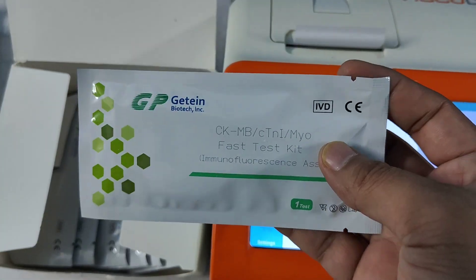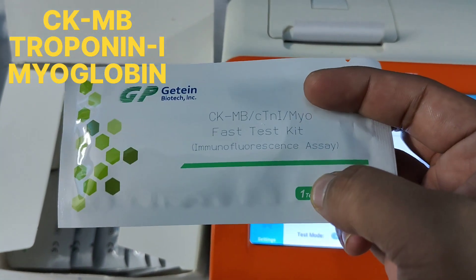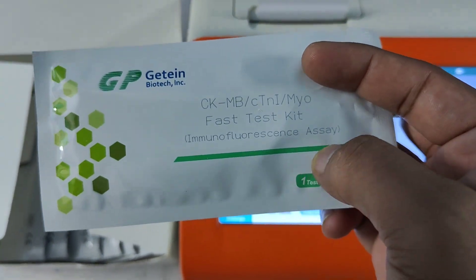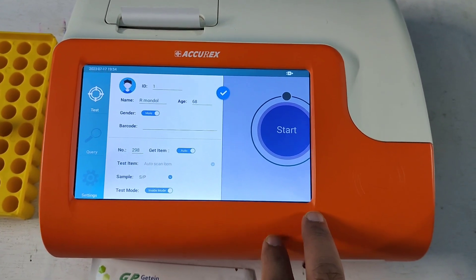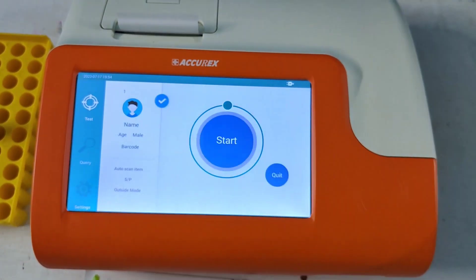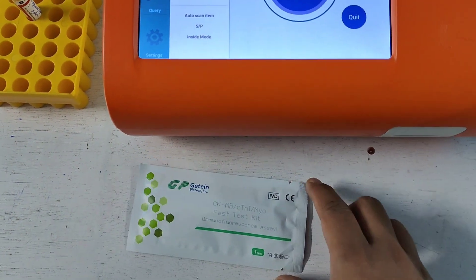Here is the kit by which I am going to perform the test. With this single kit you can easily assay CKMB, troponin I, and myoglobin. The method is immunofluorescence assay. After entering all the details in the machine, you have to click the right icon — the machine is now ready.